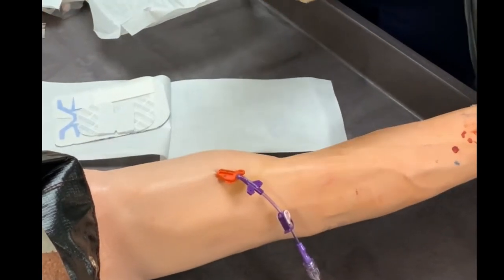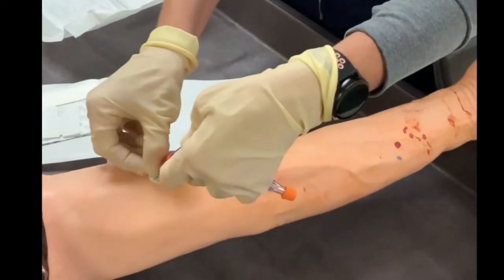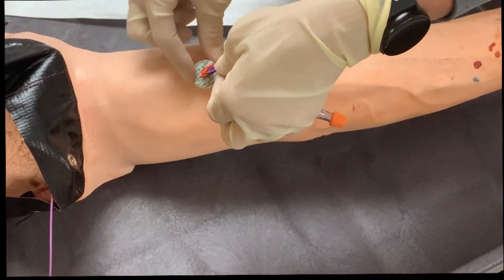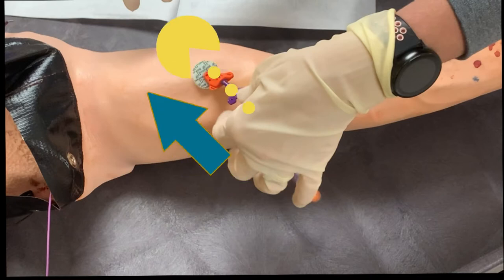If the site is dry, begin by putting the biopatch in place. There is a slit in the patch that allows it to wrap completely around the catheter at the insertion site. The foam should be in contact with the skin, and the label should be facing up, visible through the dressing. When placing the biopatch, position the slit to be in line with the catheter, as if Pac-Man is going to eat the line. This way, when you remove the dressing, the biopatch will come off smoothly.